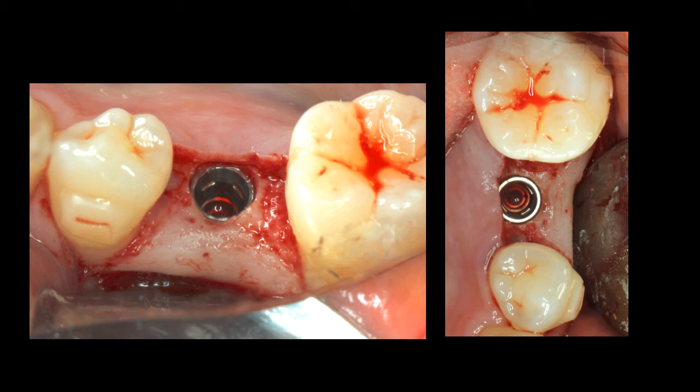As we can tell also from the right-hand picture here, my crestal incision was not in the midline. It was slightly paracrestal. Again, different practitioners practice different methods. In this particular case, it was easier for me to do a paracrestal incision so that during my drilling, I do not need to worry about reflecting the lingual flap with my other hand. Only the buccal flap was reflected.